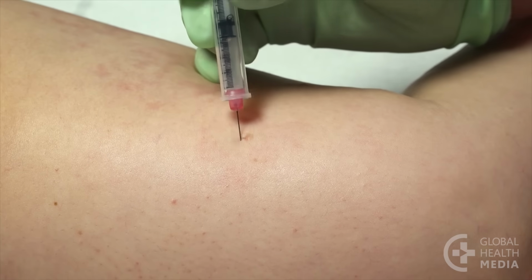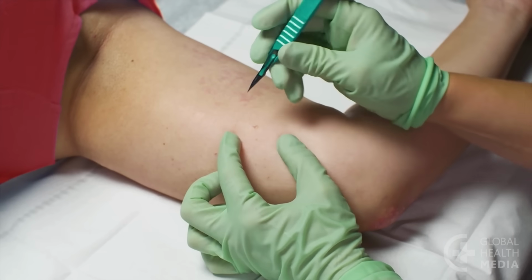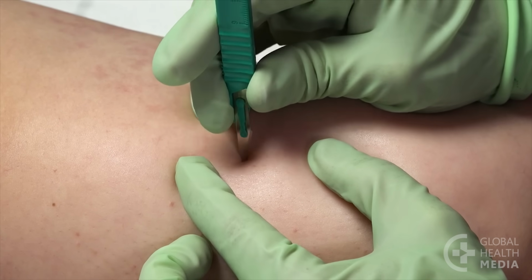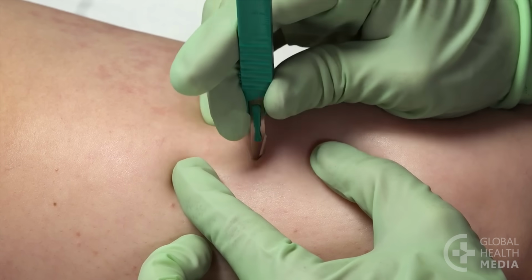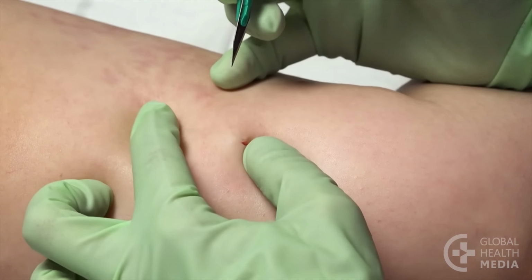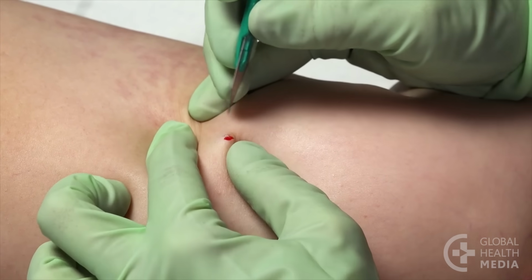When the site is numb, make a tiny 2 to 3 millimeter stab incision right at the mark. This incision is longitudinal, in the same direction as the implant. Use your fingers to push the end of the implant into your incision.